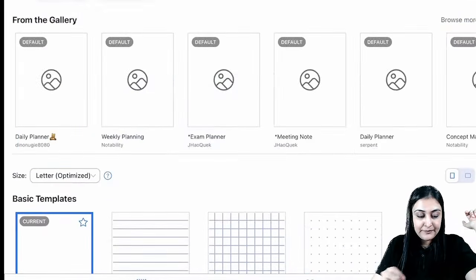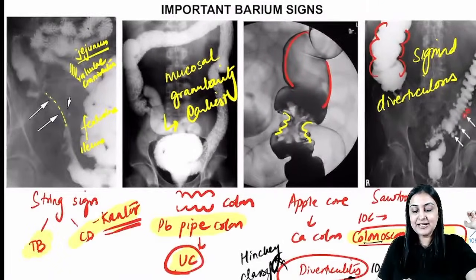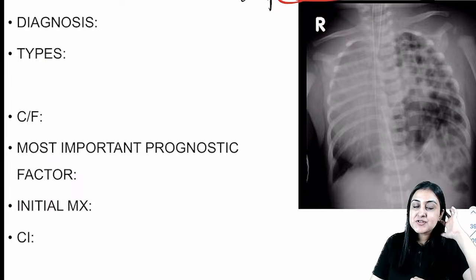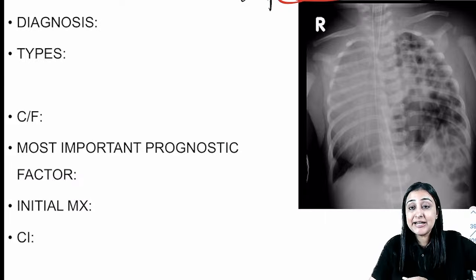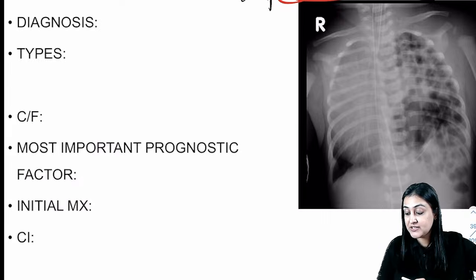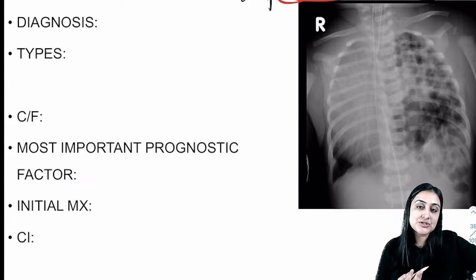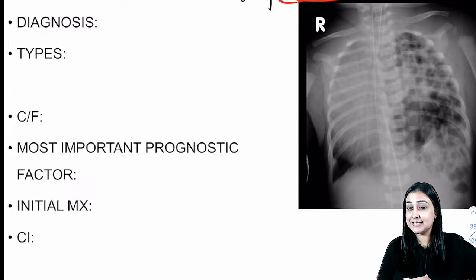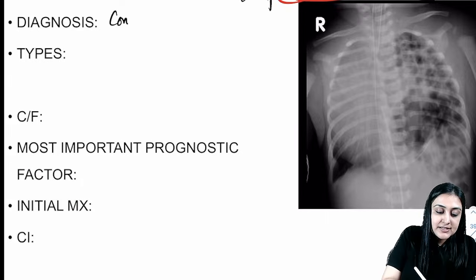Now going on to the next thing. Sorry. Yeah. So next we have, what is the diagnosis here? When you see that in the thorax you have these bowel loops, and you have a neonate complaining of respiratory distress. See, contrast is always needed, Rahul, anytime you have inflammation or tumor. So to see infection, we would do a contrast enhanced CT. To see a tumor, we would do a contrast enhanced CT as a general rule. Remember that. Okay? So the diagnosis here is congenital diaphragmatic hernia.